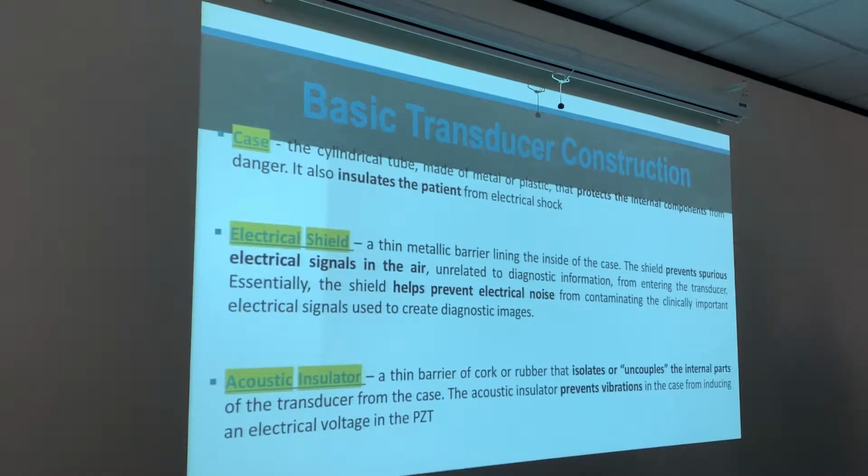That's how we get into being able to steer the beam. Remember I told you the beam just doesn't come out in one beam all the time. I can steer it this way. I can steer it this way. That's why I can have wide scan, because of beam steering, because I can steer the beam more this way if I want to. I can steer the beam more this way.